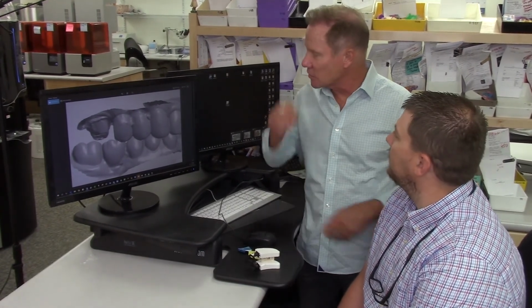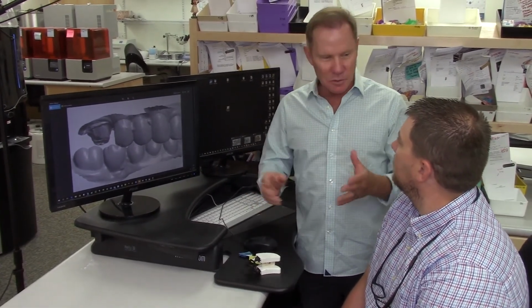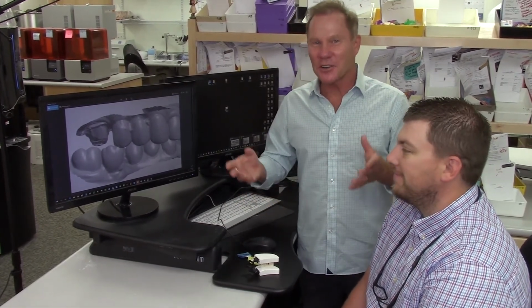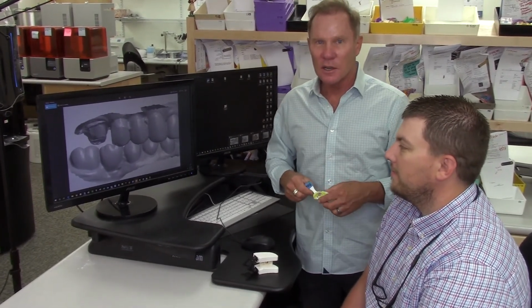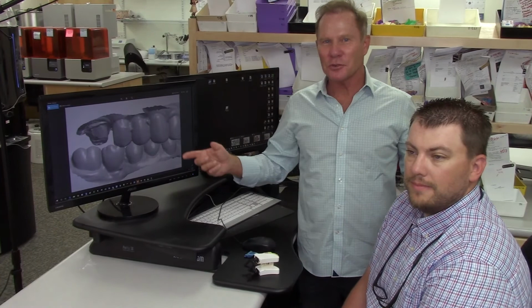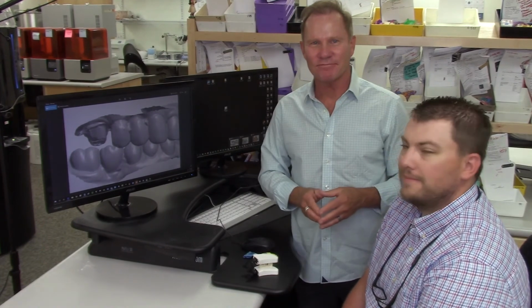Yeah, I agree. And I did a survey with Master Ceramics about 2 years ago, and again, things have changed, where I just asked them 2 questions. If you had a great doctor and they knew how to take digital, they knew how to take polyvinyl, which would you prefer? Digital. And they all said digital. And the second question was, which do you think is more accurate? Digital. So, if we think again how expensive even an impression is, impression material, time consuming, patient doesn't like it. If we can go digital, it's easier for us on this side of the bench, clinical side of the bench, and then our ceramist or our digital manager is saying it's better on this side of the bench. It just makes sense. I hope that helps.